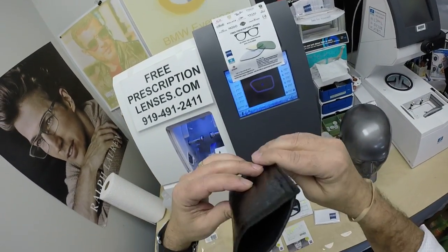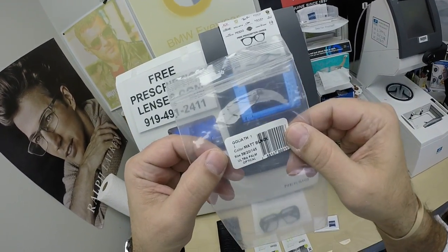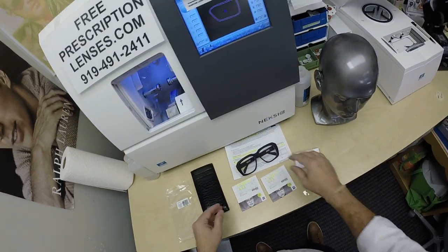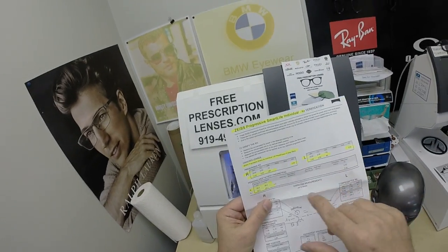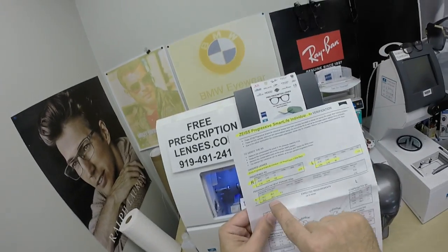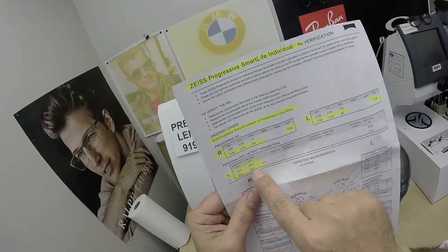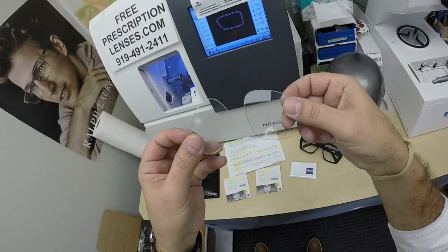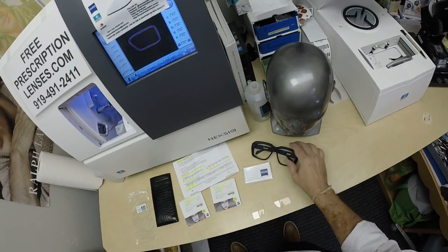It comes with the faux sleeve case. There is no hard case because these things are too large to fit in a case. It is the Goliath 1, size 58-20. There is a windshield size, the Ultra 2, and that is a 61 eye size. He's getting the Zeiss Progressive Smart Life Individual, 1.67 high index, the Photofusion Gray Black. I've highlighted the prescription for the right eye, add power, same for the left, pupillary distance, optical center height, the packets the original lenses came in, the original lenses I took out to put his prescription in. Of course, the Zeiss Cleaning Cloth and my premium microfiber cloth.